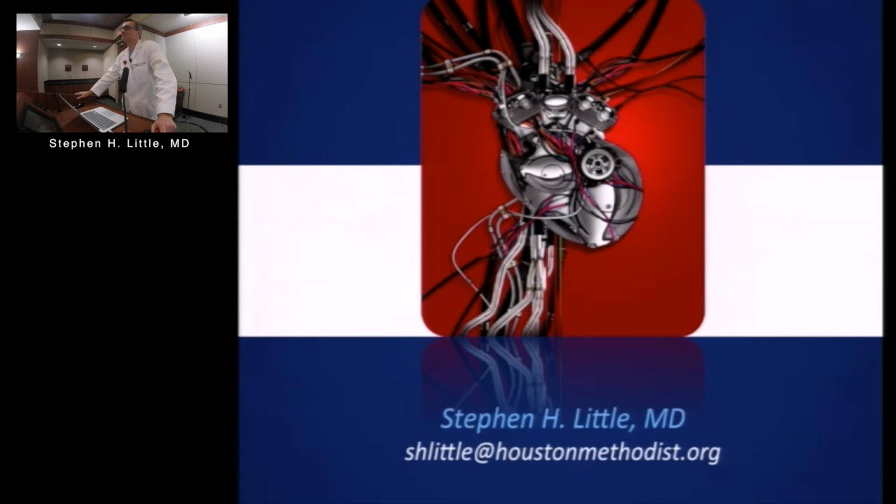Can you comment on the TE procedural time for the MitraClip? Yeah. So I'd say our first MitraClip case was probably 4 hours total time. The unpredictable part is getting one clip to the target area. It's getting faster and faster. A lot of that, I'd say now our standard MitraClip is probably an hour total.